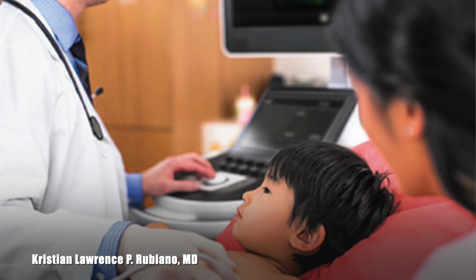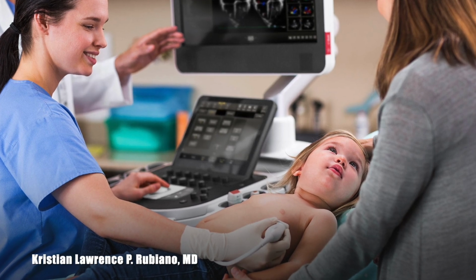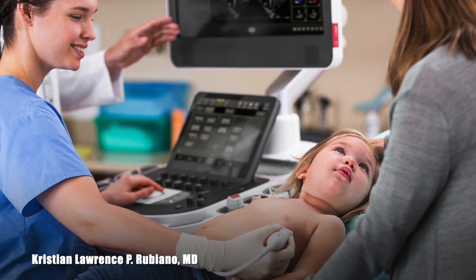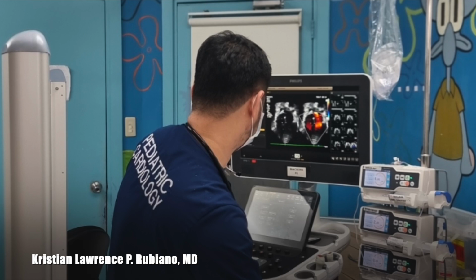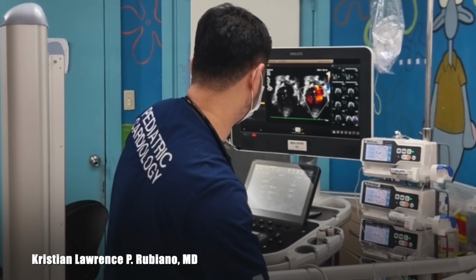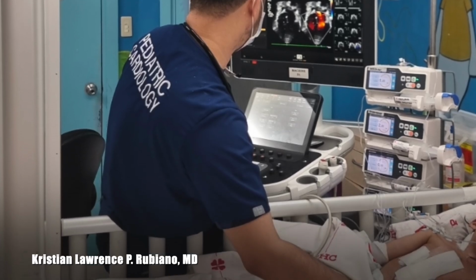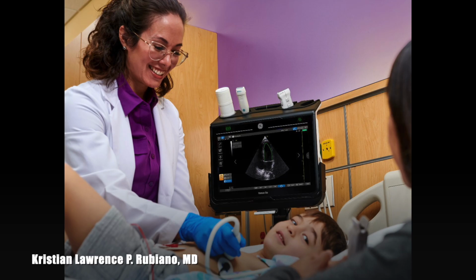In performing a 2D echo in a pediatric patient, it is a must that it is done when the patient is calm and in a comfortable position. The echocardiographer should ideally be on the right side of the patient. But in cases wherein there are a lot of contraptions or machines beside the patient, it may be done on any side that is feasible, depending on the examiner's preference.